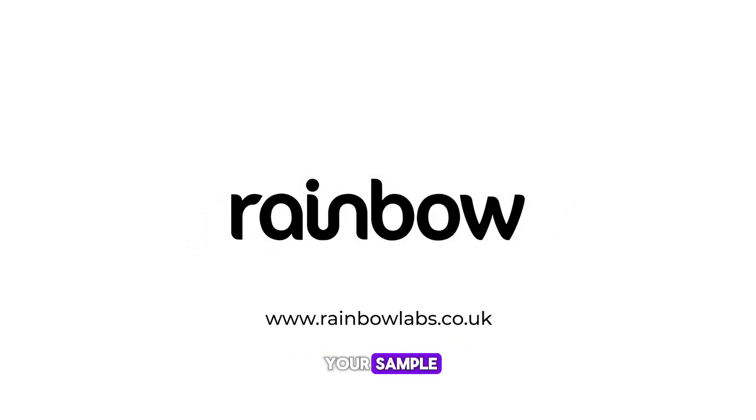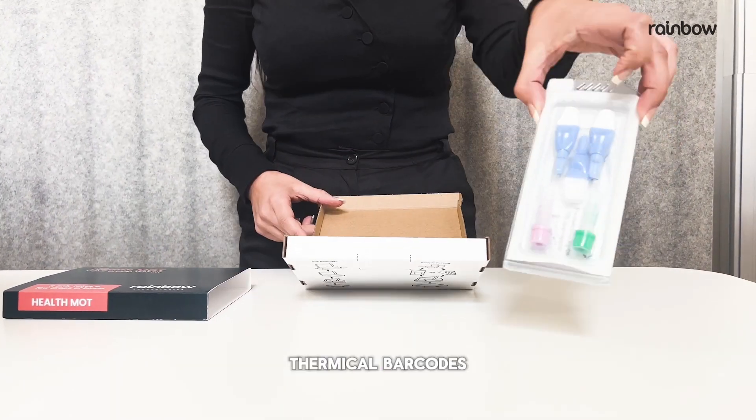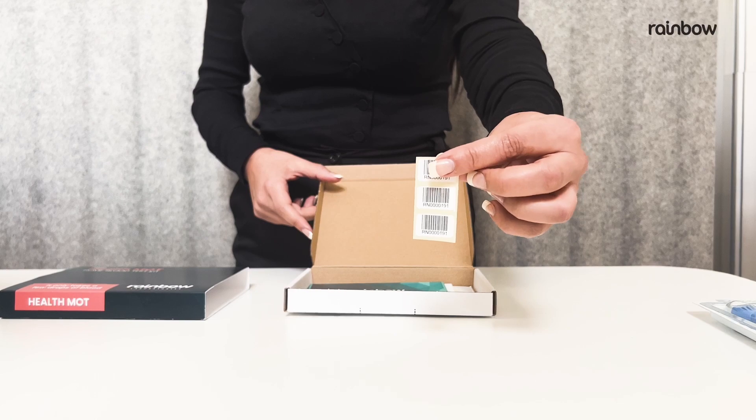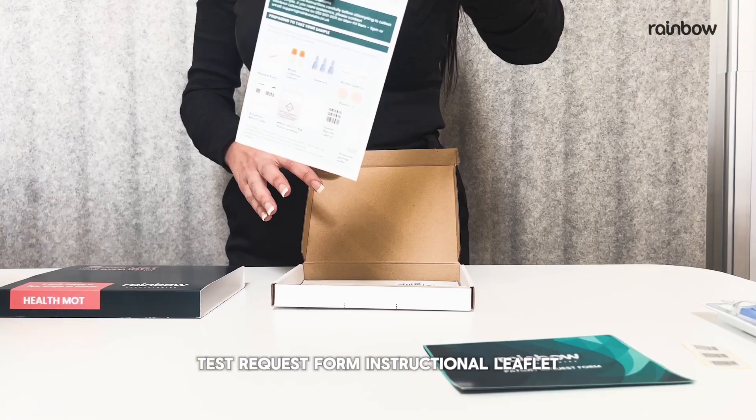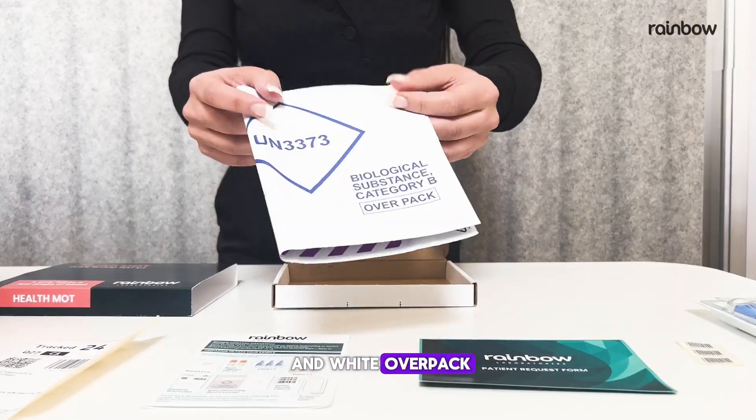As you prepare to take your sample, ensure you have all the items: kit box, thermocore, barcodes, test request form, instructional leaflet, Royal Mail return label, and white overpack.